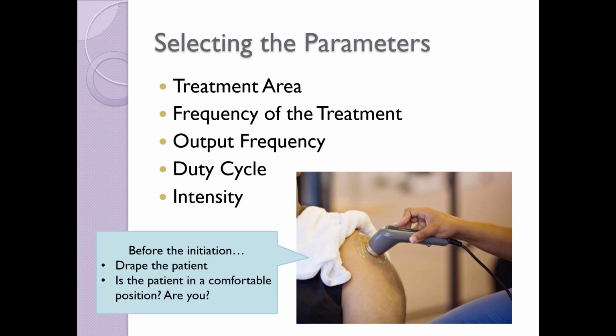In addition, you need to check with the patient to make sure that they are in a comfortable position. As a clinician, you also need to be in a comfortable position because you may be there for a while performing the treatment, and it is best to be comfortable.